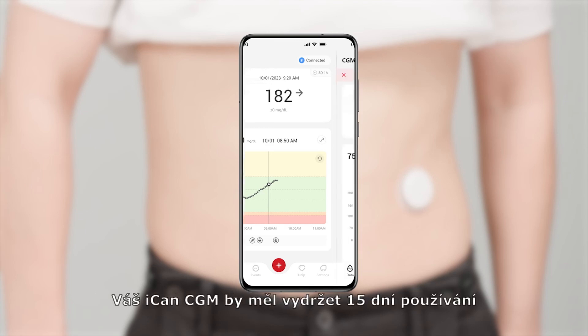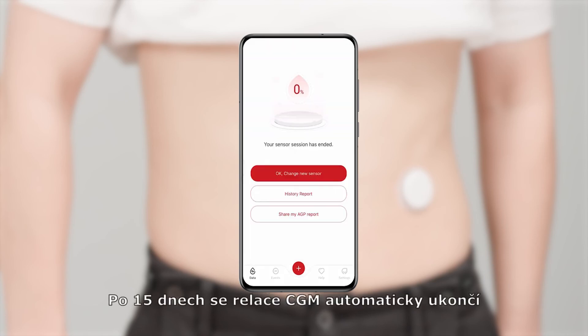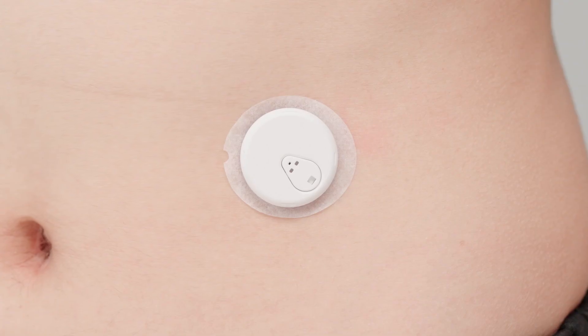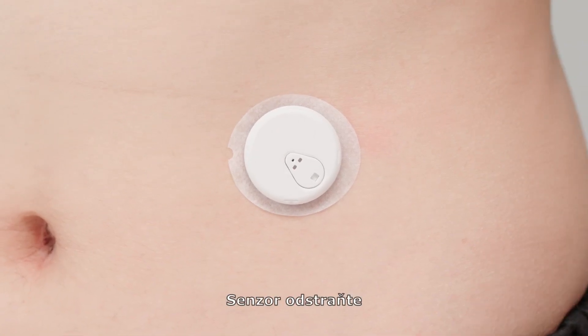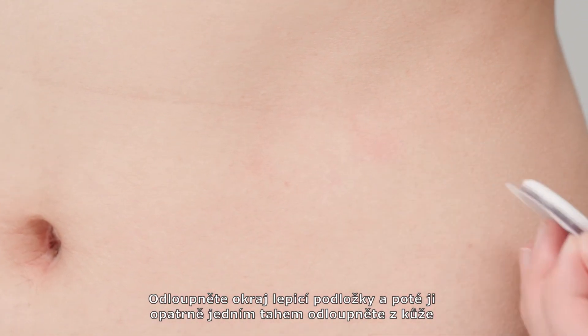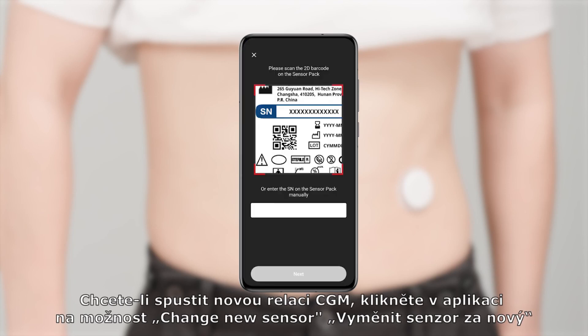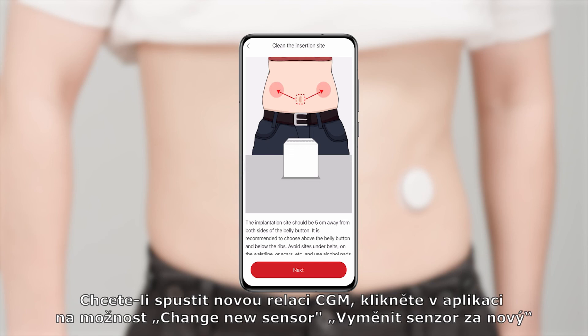Your ICANN i3 CGM is intended to last for 15 days. After 15 days, the CGM session will automatically stop. You should remove the sensor — pull up the adhesive edge, then slowly peel from your skin in a single motion. In the app, you can click Change New Sensor to scan and start a new CGM.